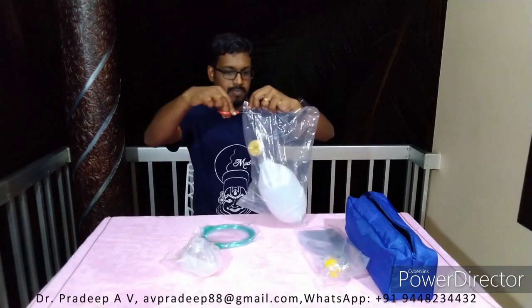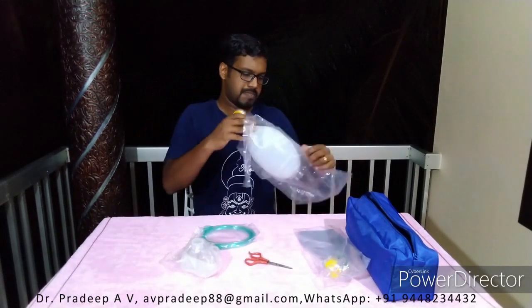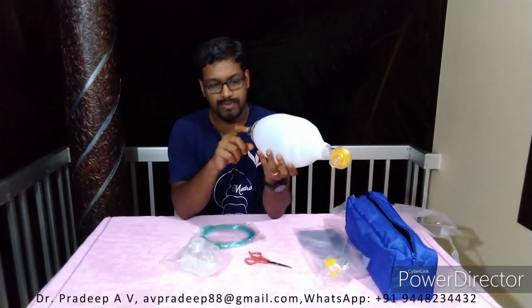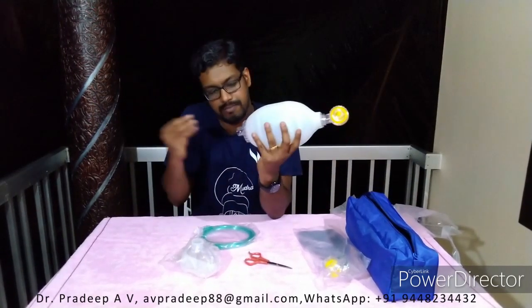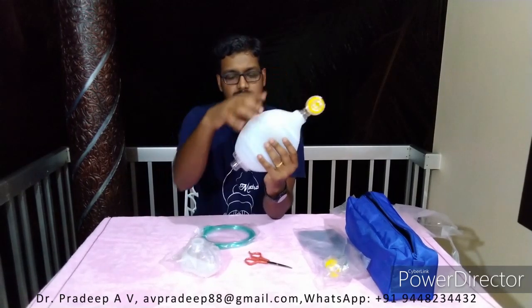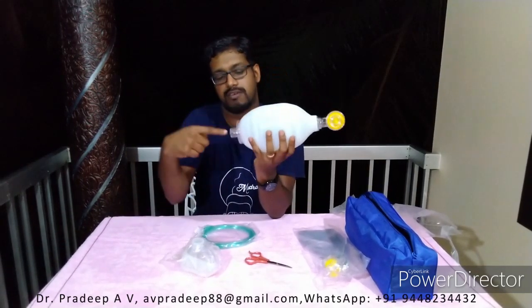This bag is supposed to be attached behind the bag. This is called the oxygen reservoir, and this is another valve, and this pipe is supposed to be connected to an oxygen cylinder and the back of the bag. Silicone bag, so it has a valve here and another valve here. It allows the flow of air from here to inside and from here to outside. So when you press, the air goes out. When you release it, the air goes in here from here.